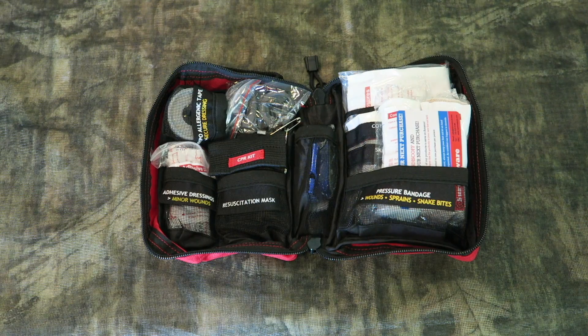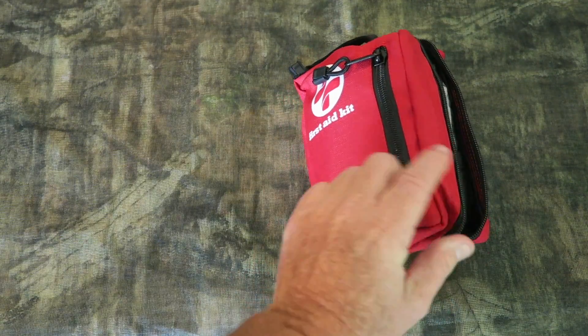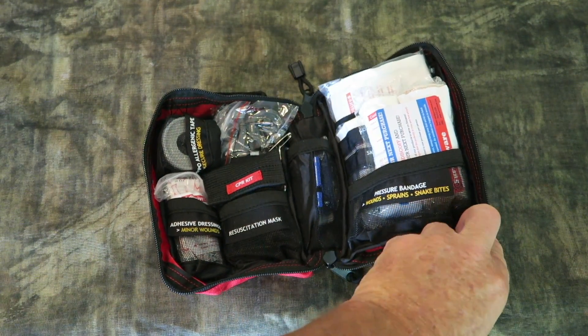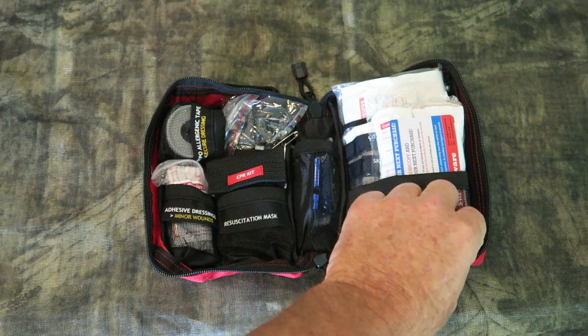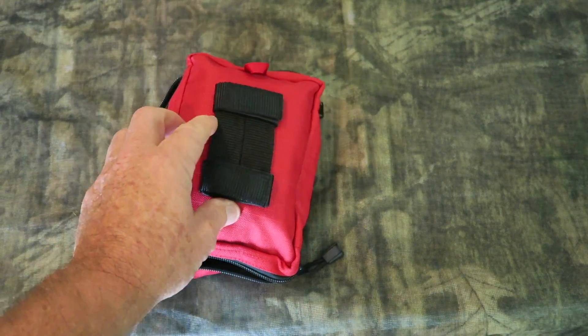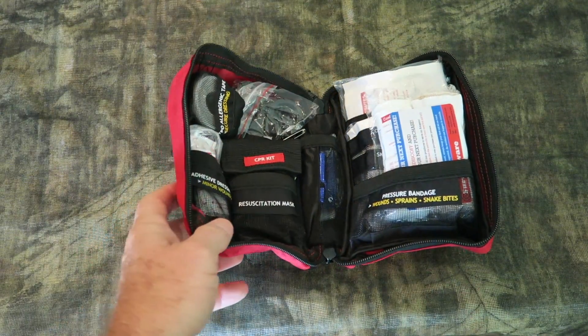My first look is pretty impressive with the case, the little pack, zipper pockets. Everything is well organized on the inside — there's just a lot of stuff. They even have a lot of everything labeled on the back. There are some little straps with MOLLE-type attachment points. You could hang it on a backpack or wherever you want.